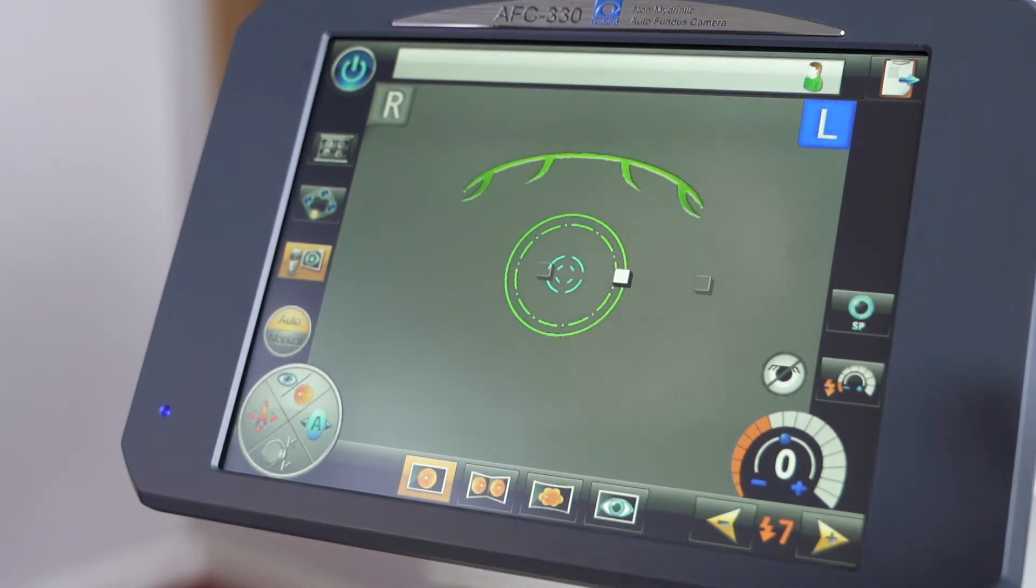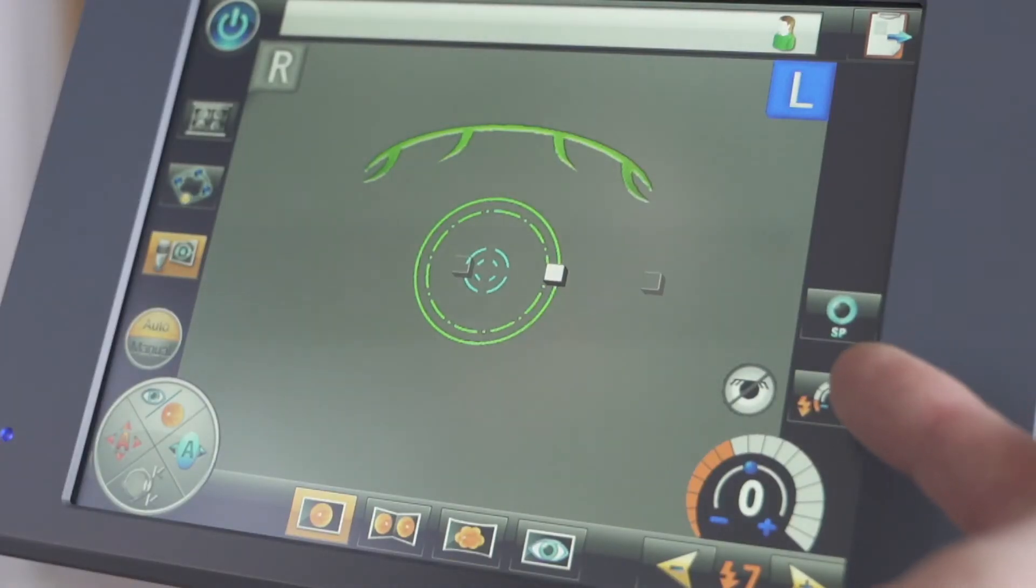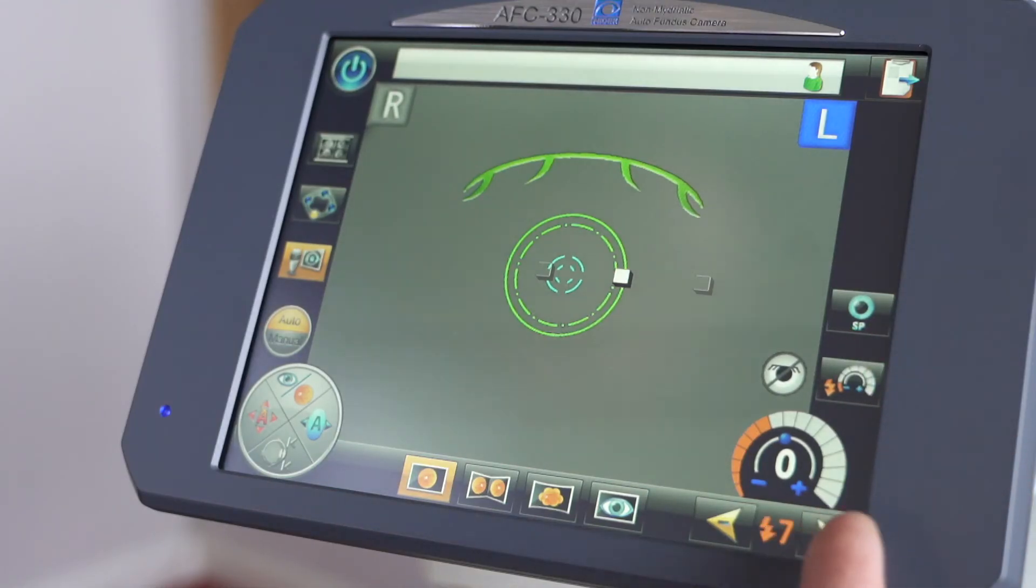On the other side we have the small pupil function. We also have the ability to quickly and easily drop the flash level. And here we do have the flash level. So we can easily move it up or move it down depending on the lighting conditions and the actual patient.